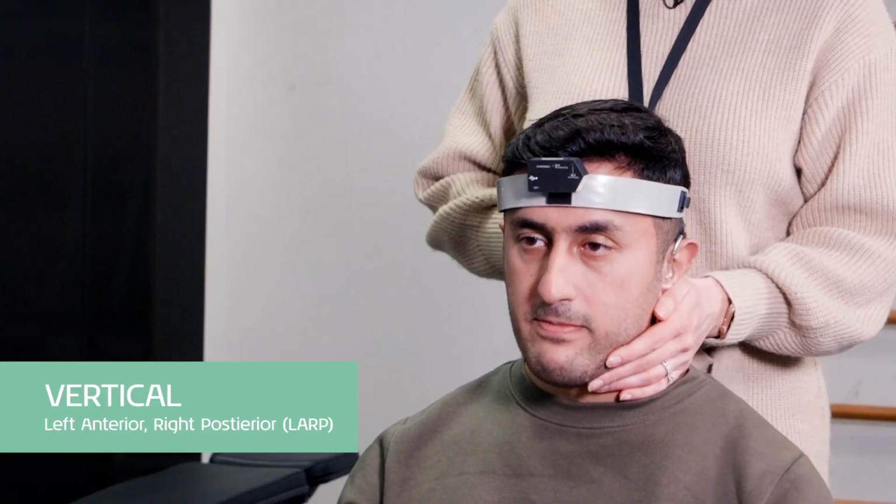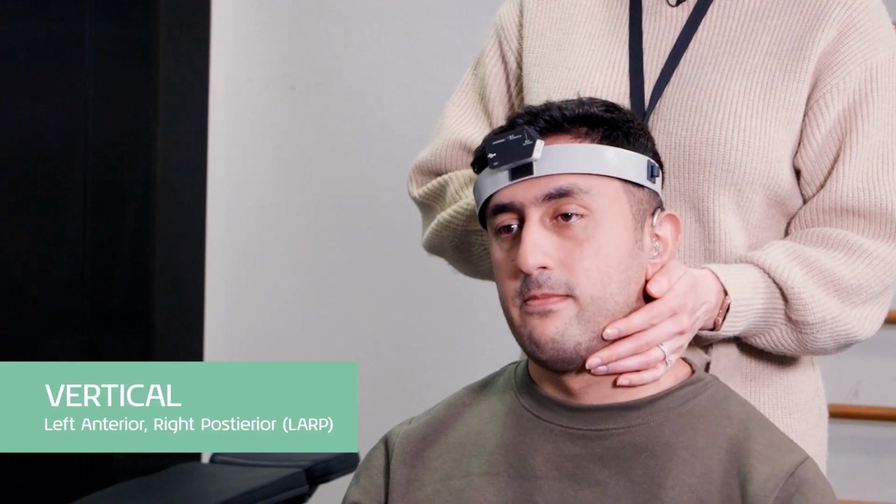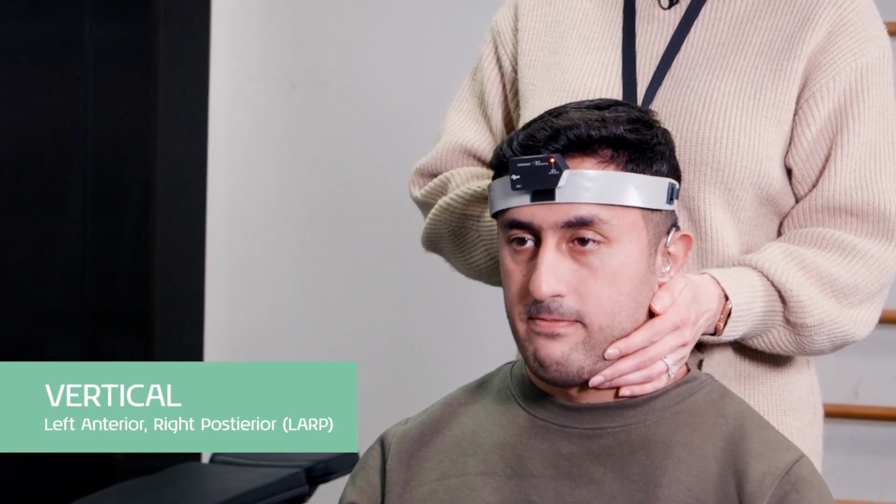Now, with functional vision head impulse testing, it's really one step further in the functional VOR. So similar to the head impulse test, we're going to move the patient's head impulsively within the canal planes, but rather than just looking at the eye moving back onto a target, we're not actually going to look at eye movement at all. We're going to look at whether the patient can have good visual acuity during that head impulse.